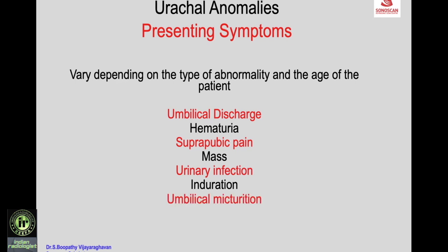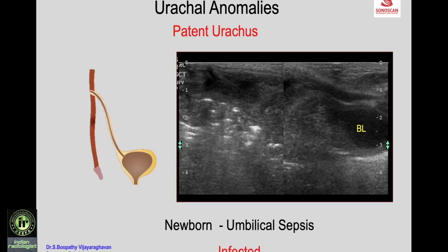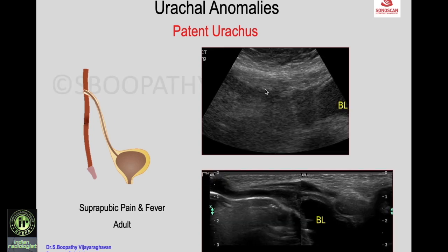A newborn presenting with umbilical sepsis and suprapubic redness shows on longitudinal scan a tender heterogeneous tract extending from the umbilicus to the urinary bladder — confirming an infected patent urachus. In an older child, the infected tender patent urachus extends from the umbilicus to the bladder, and in an adult after treatment only a narrow tract remains following antibiotics.